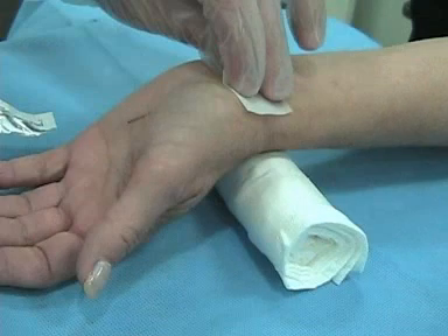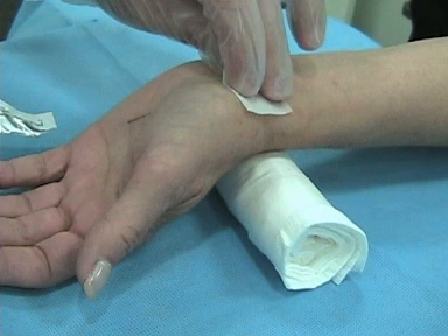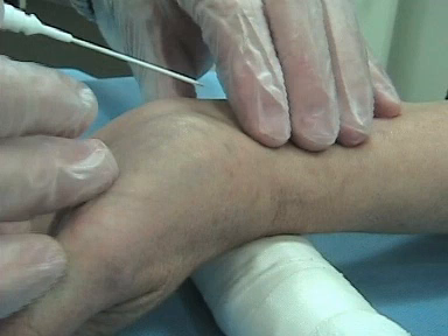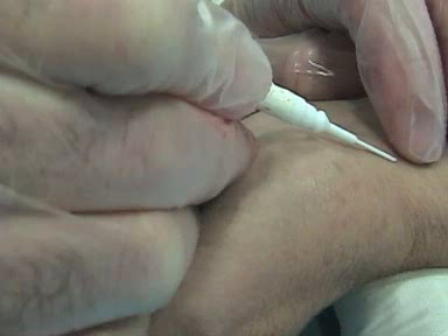Do your usual prep, and ideally put a little bit of local anesthetic in here because art lines do hurt. Notice the needle is coming in at a really shallow angle — you want to be able to hit the artery, and once you get blood, advance a little bit. If you come in at a steeper angle you might go through it.